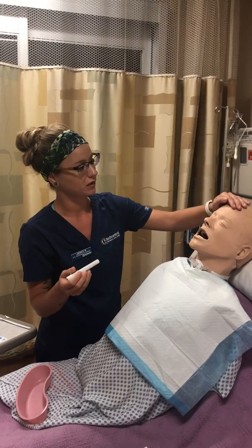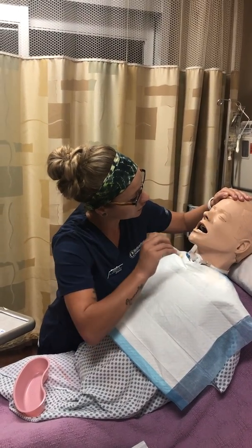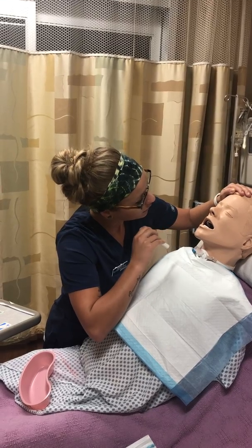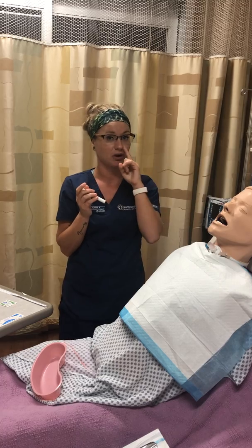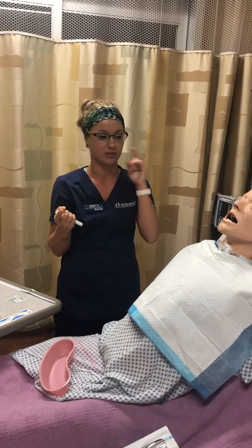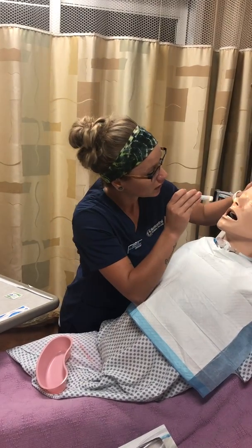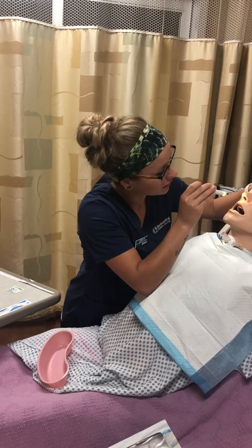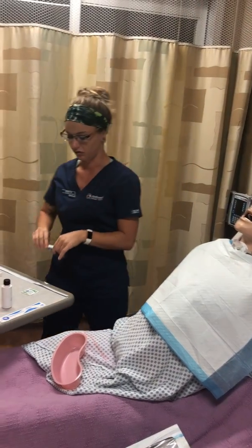So Jennifer, I just want to take a look. I'm going to hyperextend your neck here so I can visualize your nostrils to see which one to go in through. Okay, and I'm not noting any obstructions. I can also have the patient alternate breathing through each nostril by occluding the opposite nostril, and she would tell me which one she's able to breathe better through. I see the left nostril has the greatest airflow, so I will use that nostril for the insertion.